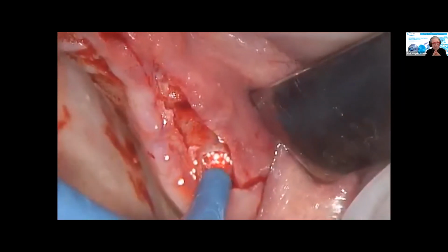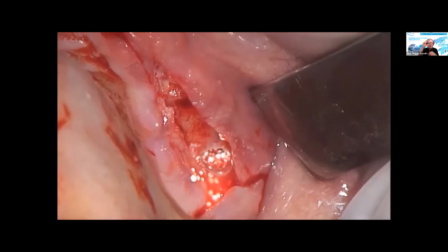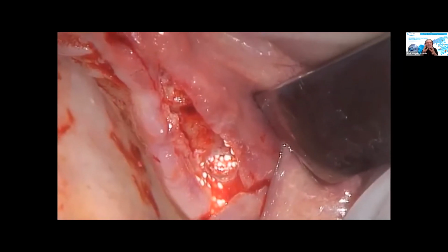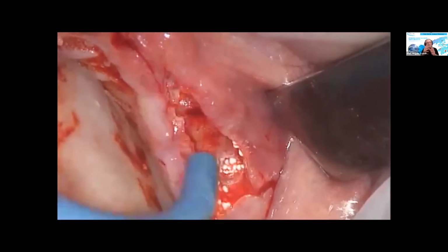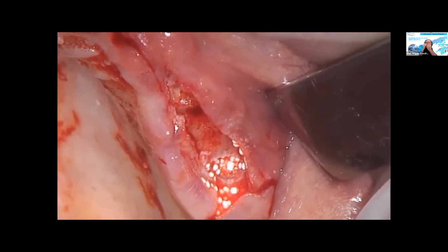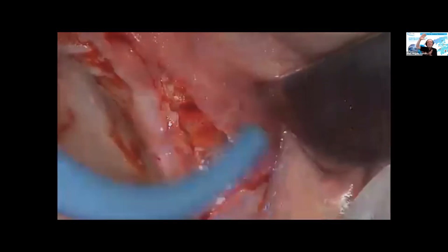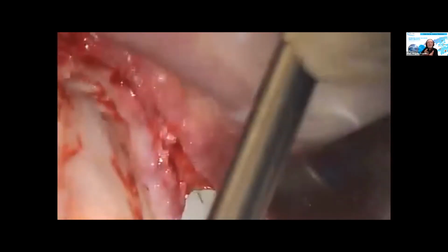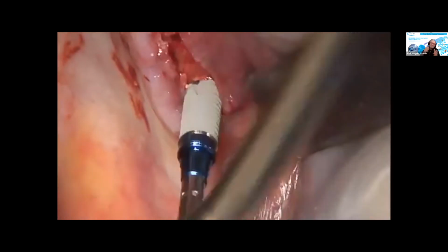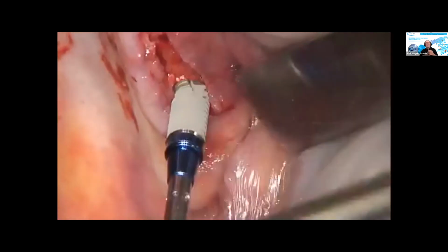And I have to repeat myself. When you use the drill, please be careful. You know you have 4 millimeters of remaining alveolar crest height. And if you have a bad coincidence, you drill in, let's say, for 6 or 8 millimeters, and the patient exhales. High pressure is built up in the sinus cavity. The already loose unperforated membrane then is pressed against the rotating drill, and then you have a secondary perforation. And this would be a pity because this then would jeopardize the entire procedure.